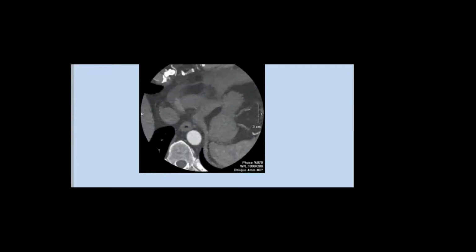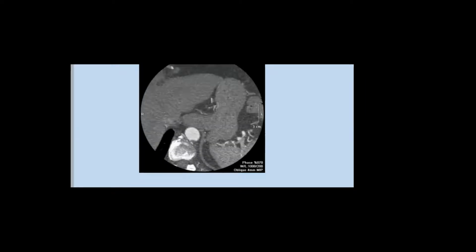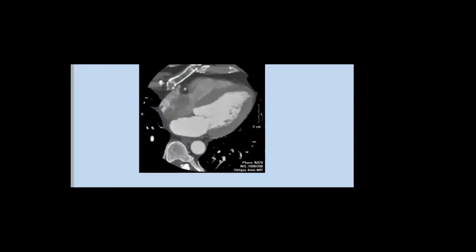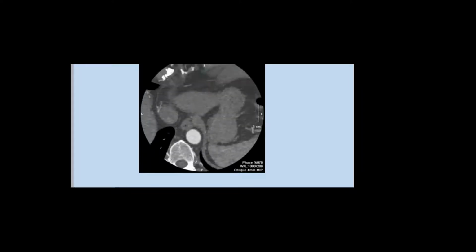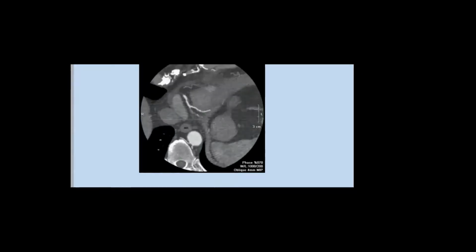And we don't see much of neck structure because our scout, remember, our scout starts from the carina to the diaphragm. And we don't see much of the lungs, right? Why? Again, because our scout is limited to the heart, so we don't include the entire lung fields. We go from the carina down to the diaphragm, and we include part of the lungs on both sides, but not all of it, to minimize radiation exposure.